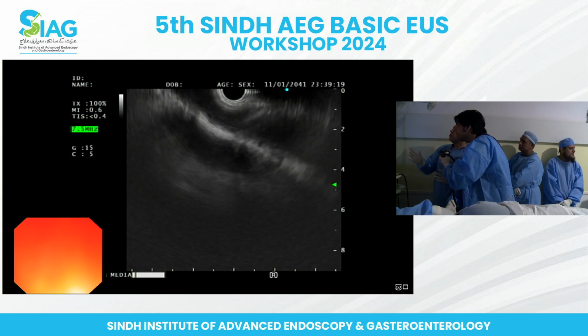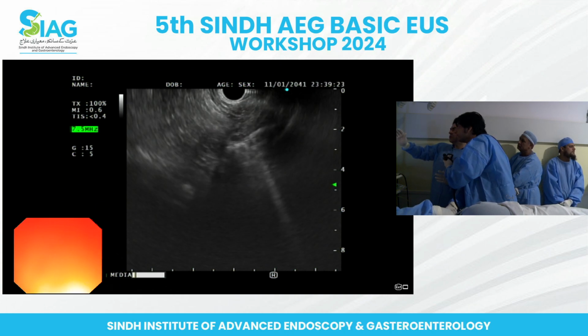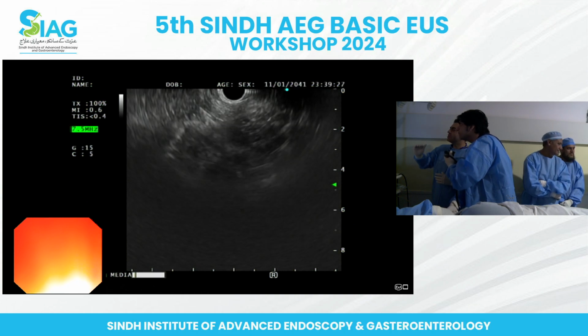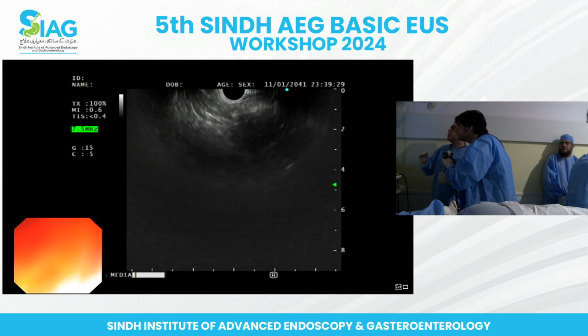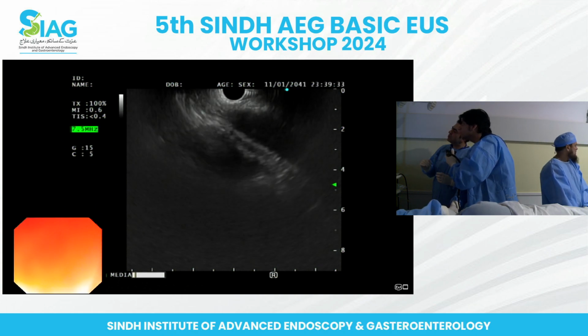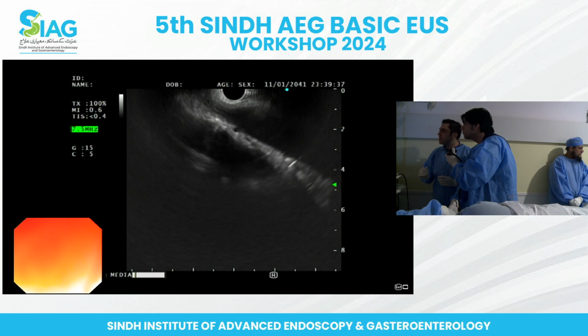Okay, so we do slip through, yeah, excellent, that's the aorta, but it's quite horizontal, which probably means you're quite high up, or you're pushing it with the wheels. So put the wheels in the neutral position, and then see if you can push the scope gently in, yeah? So you're quite high up, I think, yeah?